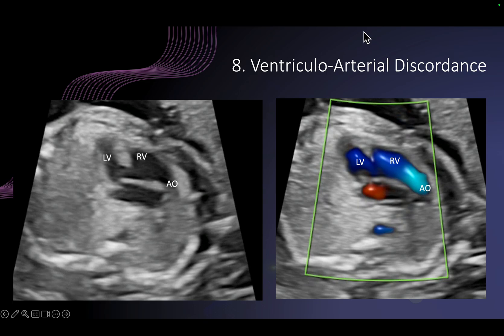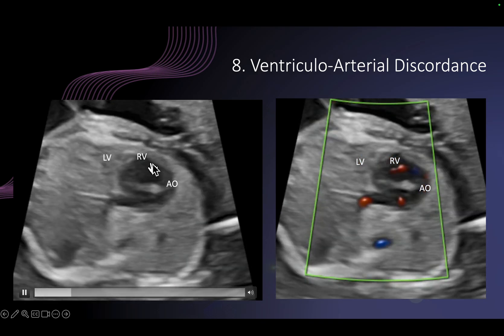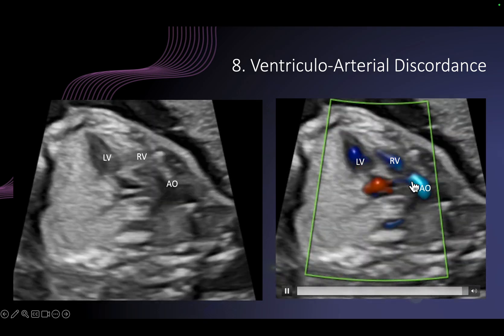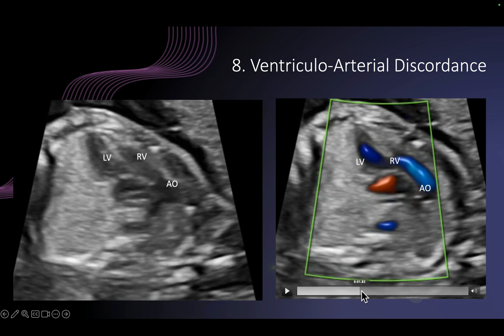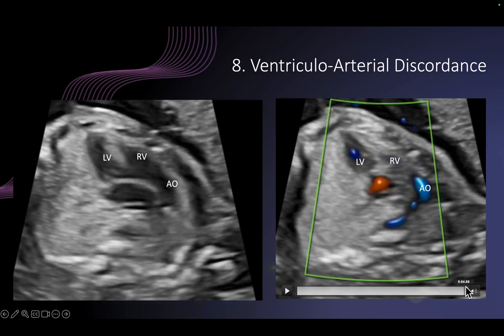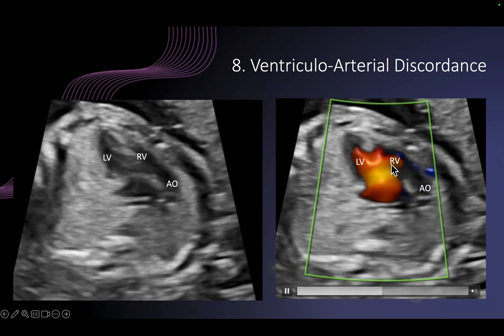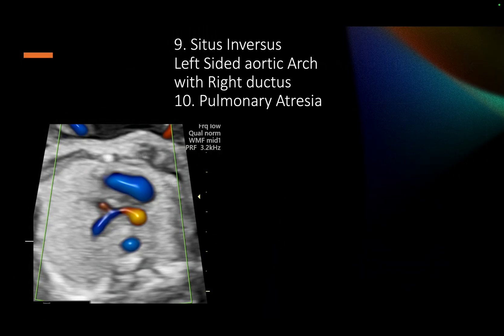The next step in the segmental sequential approach is to see the arterial relations and arterial connections. This is the left ventricle, this is the right ventricle, and you notice the large artery coming out of the right ventricle — this large artery is the aorta, which arches forward. As we scroll forward, you see this aorta going right from the right ventricle, arching cranially. Here is a large VSD which is the exit of the left ventricle. So the aorta was arising from the right ventricle.